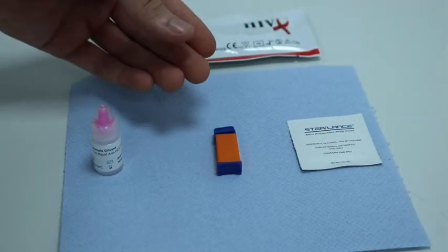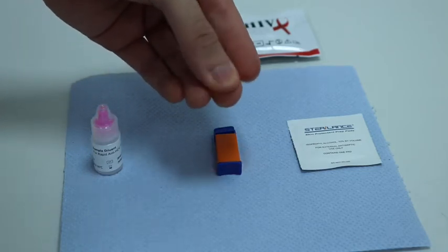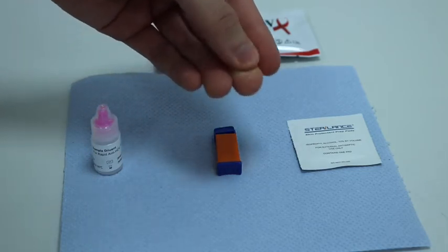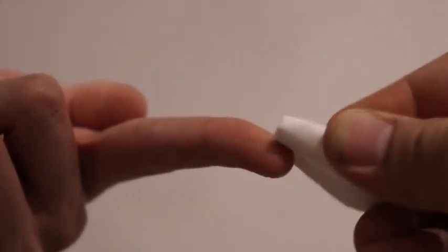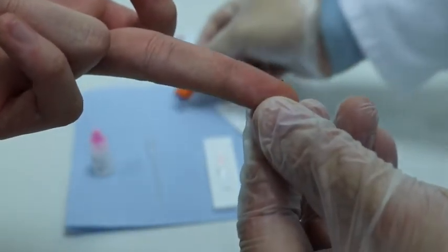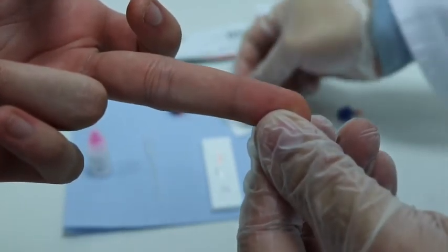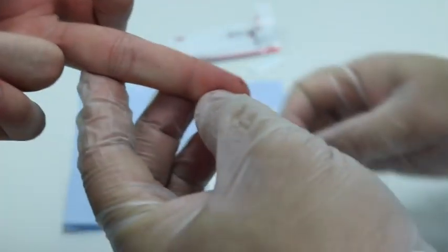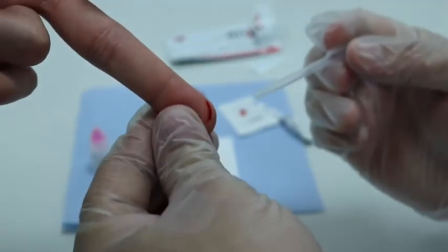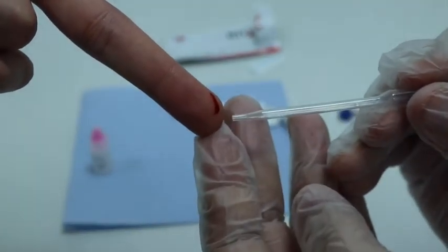In order to ensure the proper amount of sample is collected, ask the patient to sit with their hands pointed to the floor so that the blood may flow to the patient's fingertips. Wipe the finger with the alcohol swab, place the lancet on the side of the finger and press until you hear a click. Wipe the first drop of blood with the alcohol swab and wait for a blood drop to form on the finger. Keep the finger facing downward and massage if necessary to allow the proper amount of sample to form.